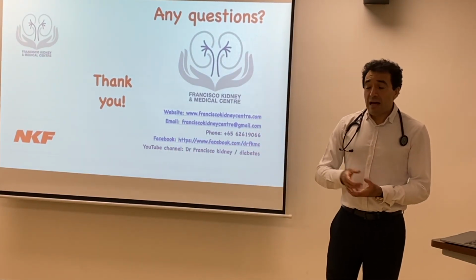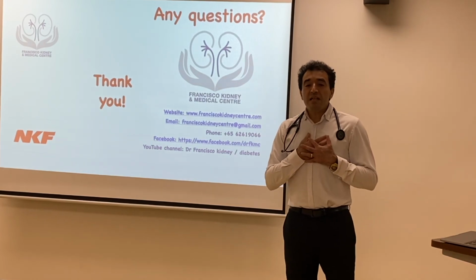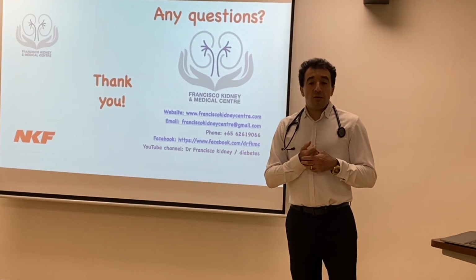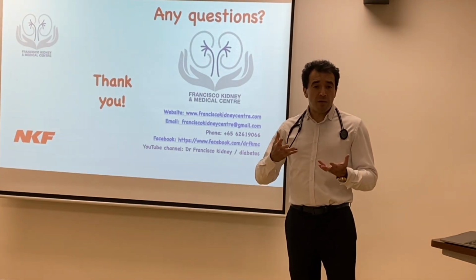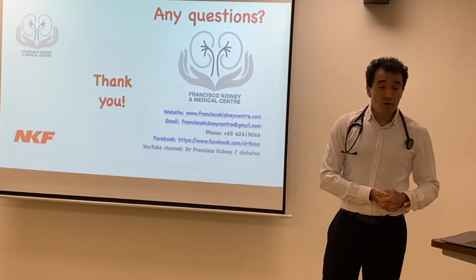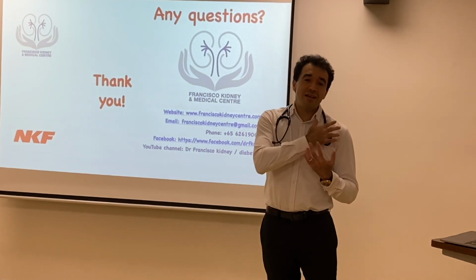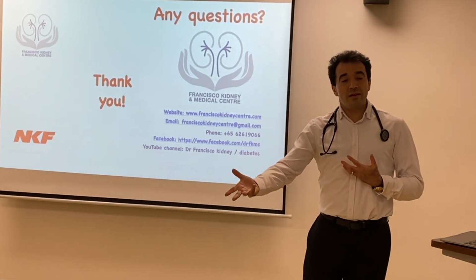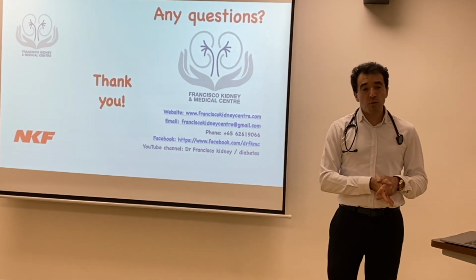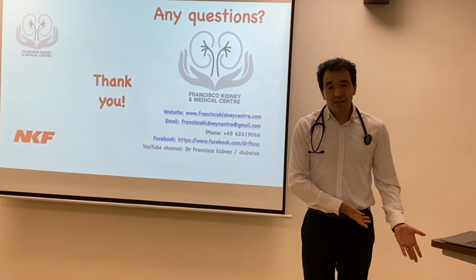A guy with a flu who starts with chest pain that is worse when breathing could indeed be myocarditis, but if you see ST elevations, it is most likely pericarditis. An old man with two previous MIs and chest pain radiating, and you see ST changes, is more likely an MI.